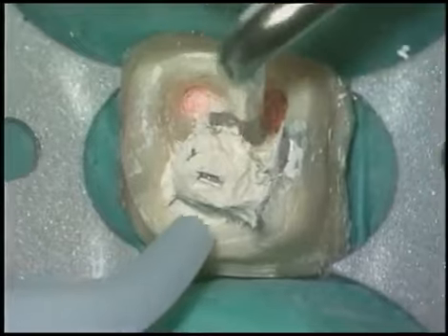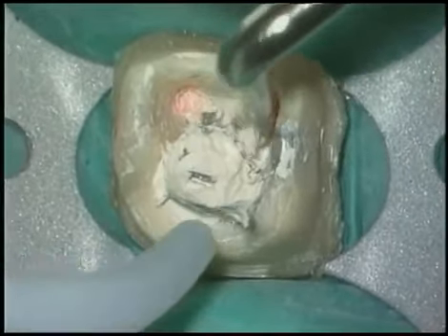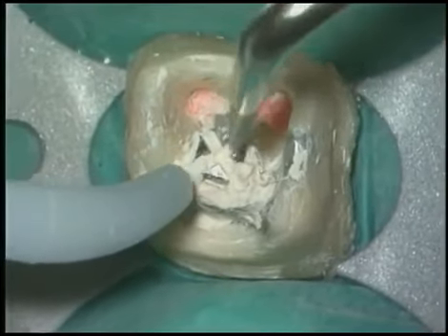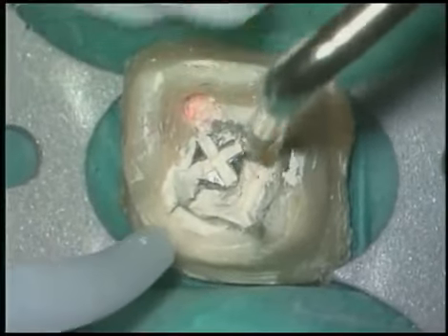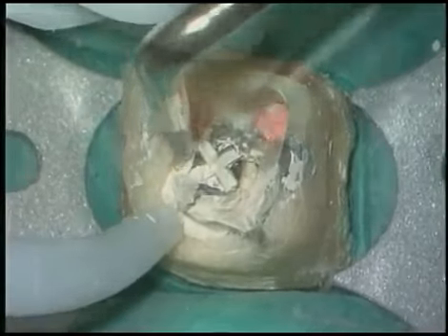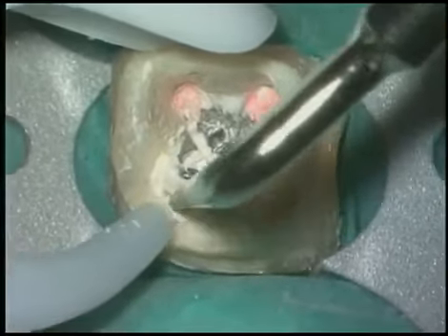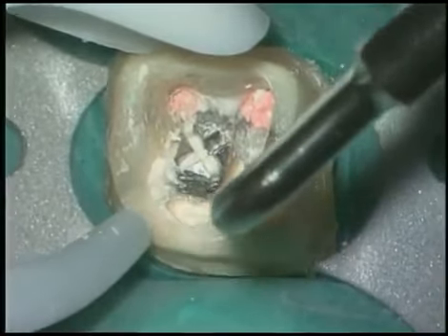In this case, the chamber has zinc phosphate cement, and it is very easy to disintegrate and blow this material out with ultrasonic energy. We progressively free up the post by using a light touch. The tip of the instrument is very lightly used on the cement, and the Stropko white Mac directs air in a very controlled manner to blow debris up the suction hose.